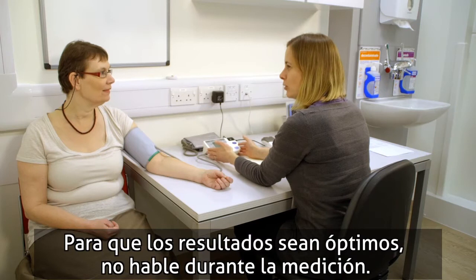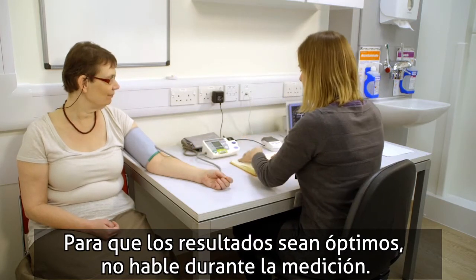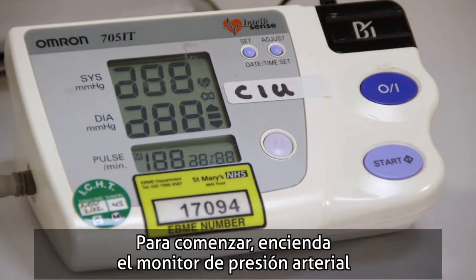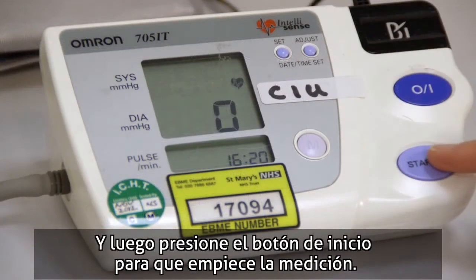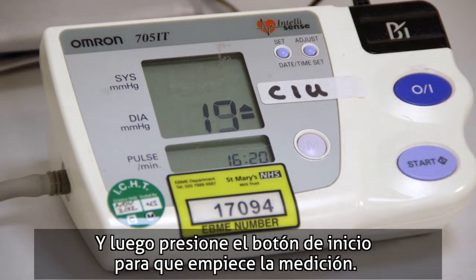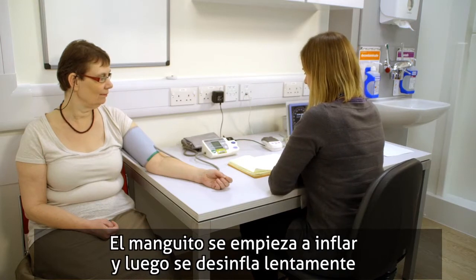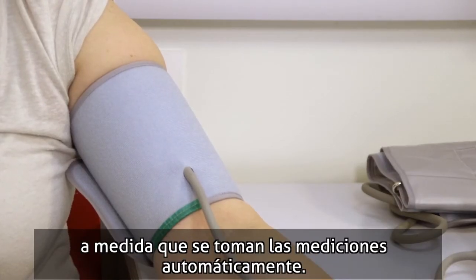For best results, don't talk during the measurement. To get started, simply turn on the blood pressure monitor by pressing the on-off button, and then press the start button on the device to run the test. The cuff will begin to inflate and then slowly deflate whilst taking the measurements automatically.